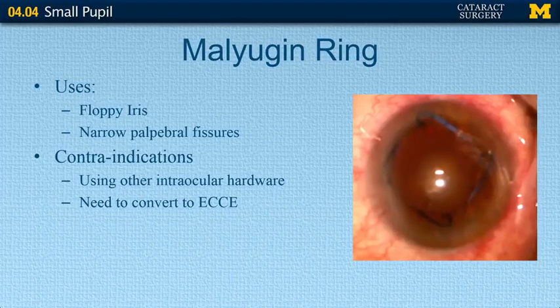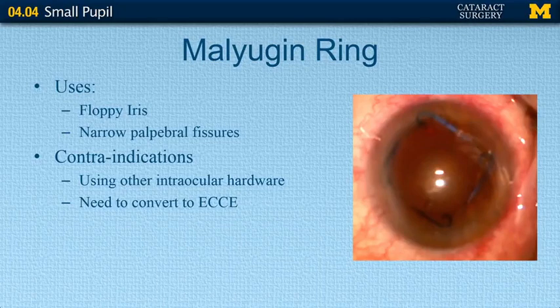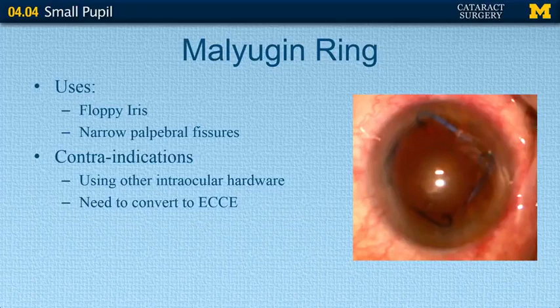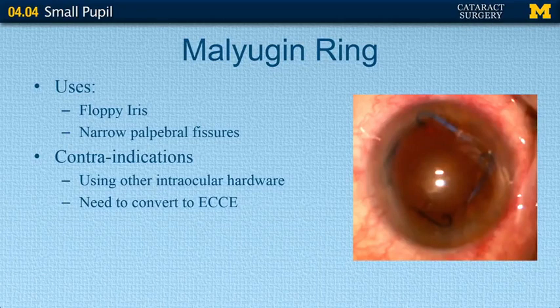The Malyugin ring is very popular nowadays. It comes in both a 6.25mm and 7mm size, and is essentially a ring device that helps dilate the pupil. Its major indications include floppy iris and cases of a narrow palpebral fissure. However, don't use it in cases where you'll be using other types of intraocular hardware or where you need to convert to extracapsular cataract extraction.